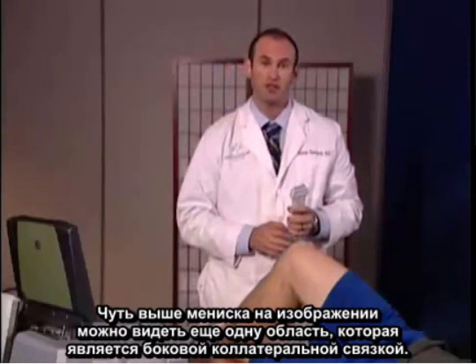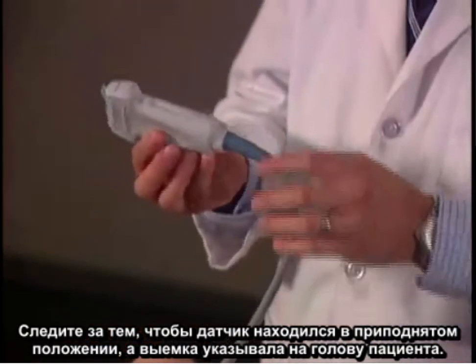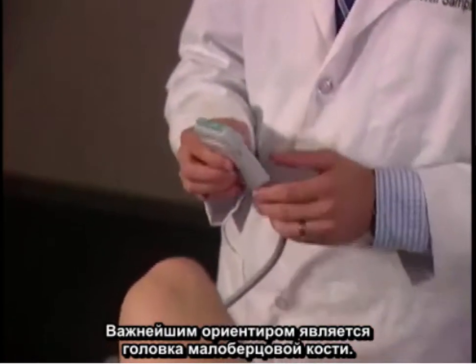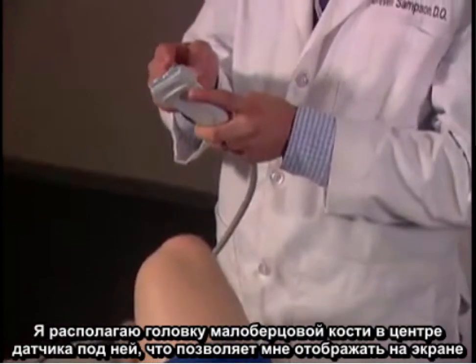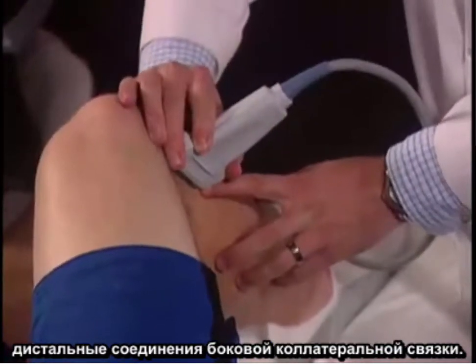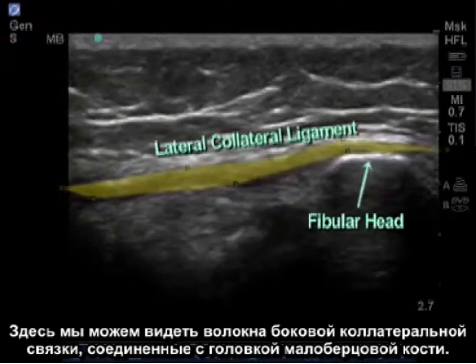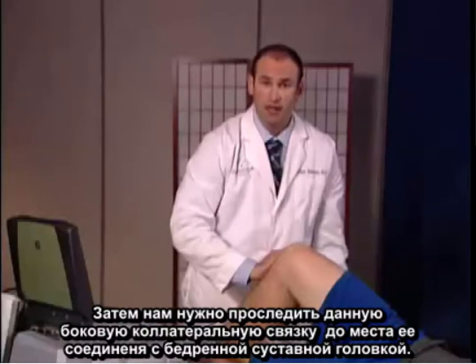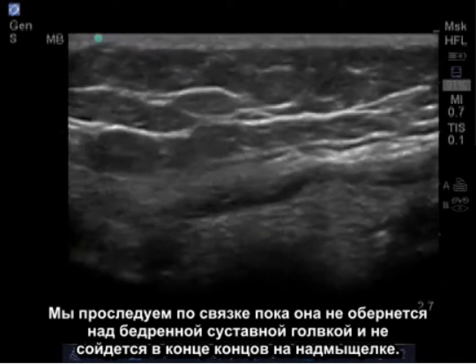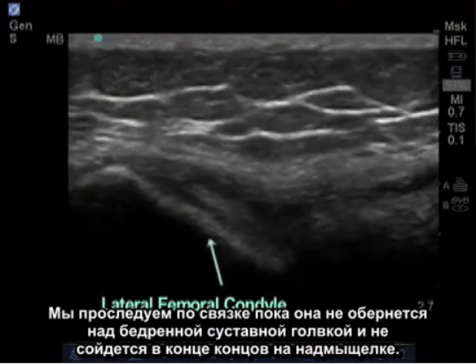The next structure to image lies just above the lateral meniscus, which is the lateral collateral ligament. Maintain the transducer in the superior position with the notch facing towards the patient's head. An important landmark is the fibular head. I like to keep the fibular head in the center of the transducer beneath it, which will allow me to visualize the distal attachment of the lateral collateral ligament. Here we can see fibers of the lateral collateral ligament attaching on the fibular head. Next, we trace this lateral collateral ligament up to its attachment on the lateral femoral condyle, following it as it continues to pass above the condyle and eventually tapers back onto the epicondyle.